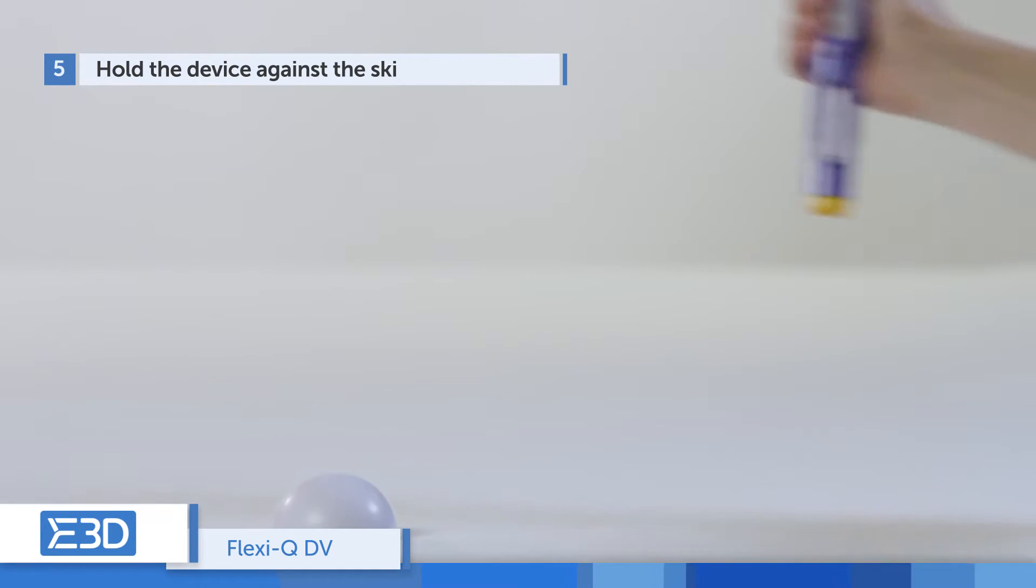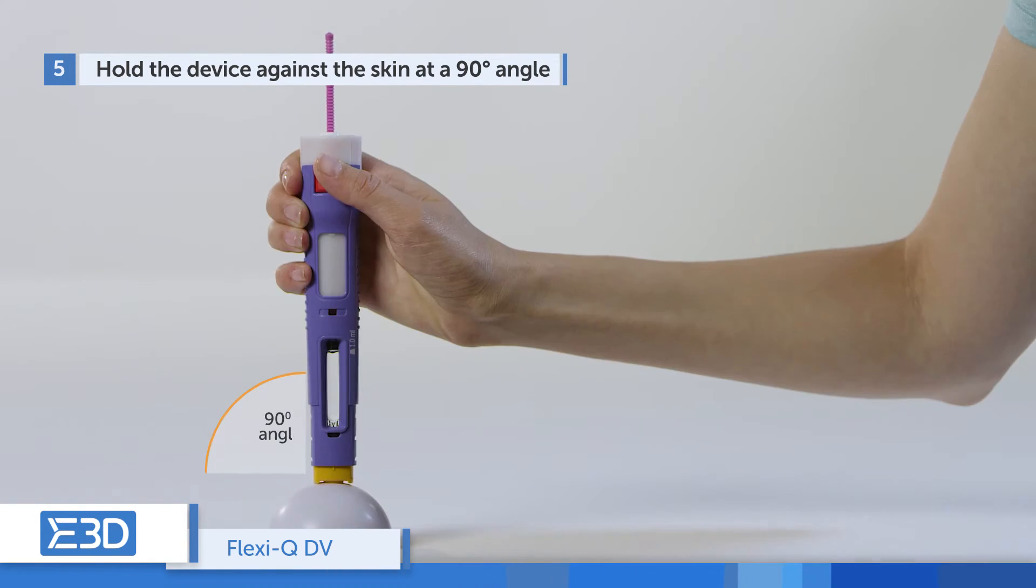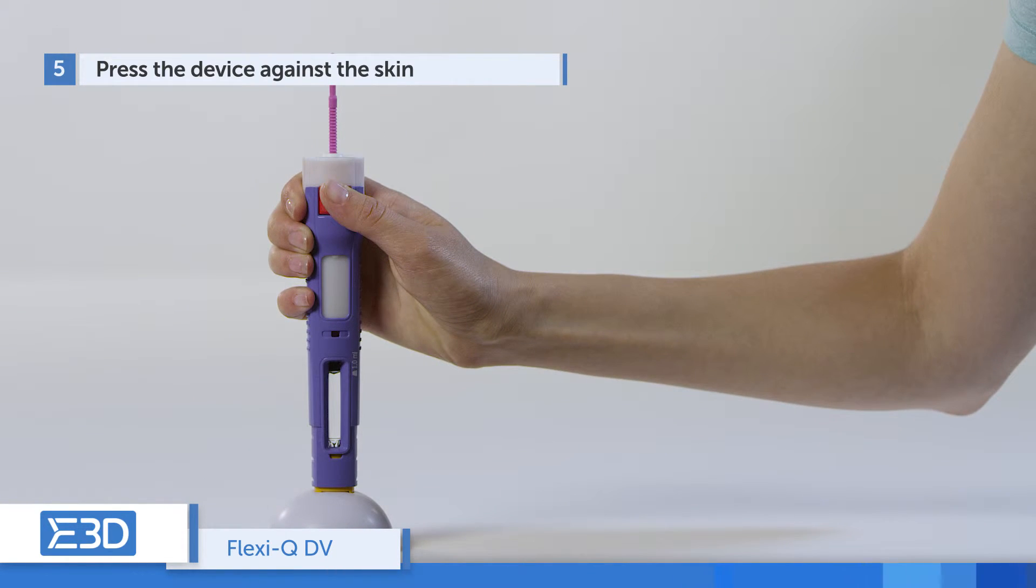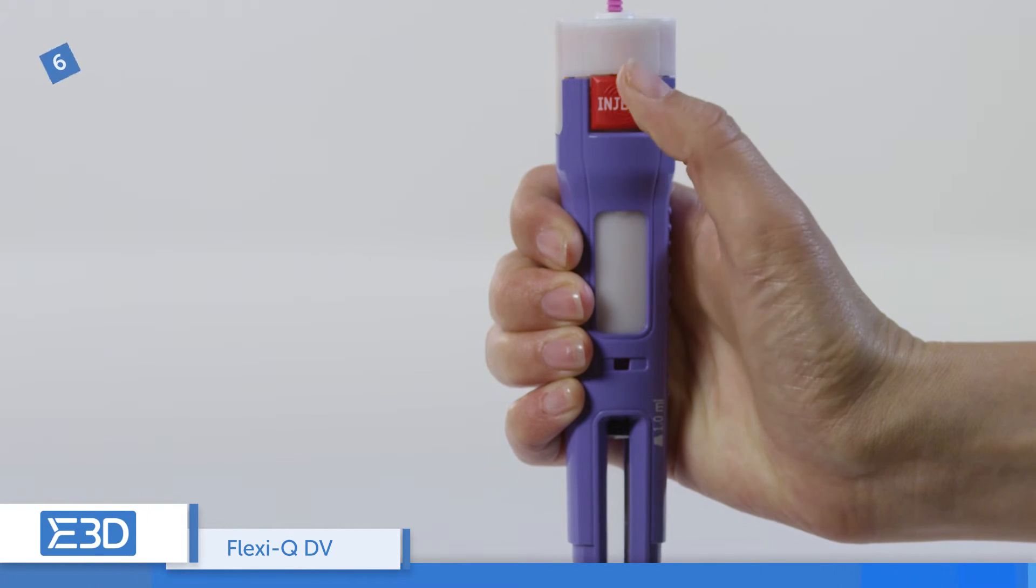Hold the device against the skin at a 90 degree angle. Press the device against the skin. Press the inject button.